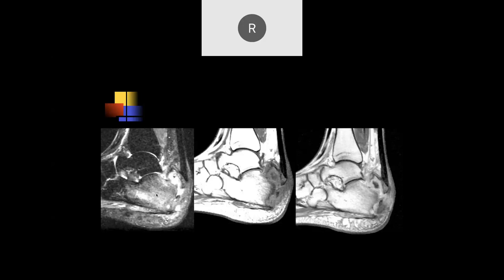If this were just an avulsion fracture, you tend not to get this much diffuse edema. You could have hemorrhage with an avulsion fracture, but here on the T1-weighted images, this looks much more chronic. This is someone who had chronic osteomyelitis that weakened the bone and got a traction injury in an area of pre-existing osteomyelitis.